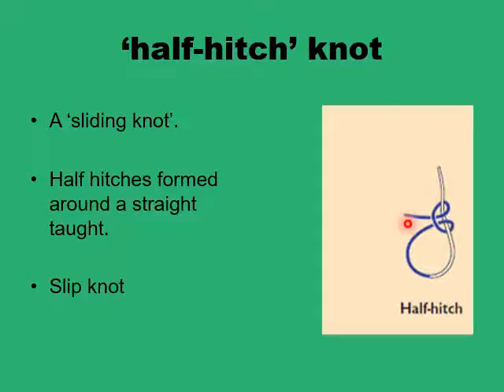And at the end you would want to secure the knot by interlocking the other two throws in different directions so as to form a secure knot. This is the type of knot that you use if you want to move a knot by sliding across a straight suture end in deep structures like cavities, or if you're doing tonsillectomy, for example.